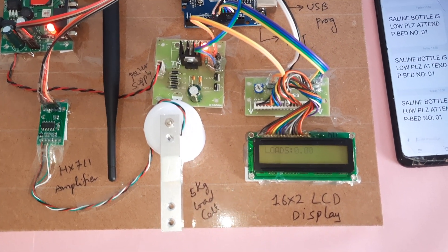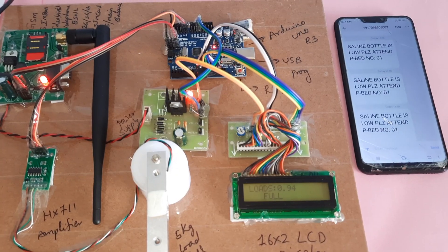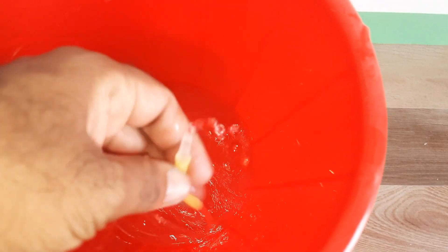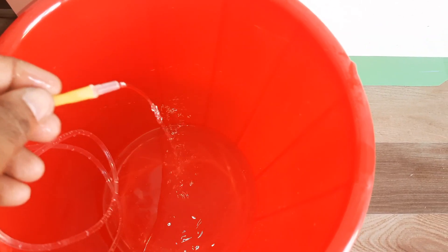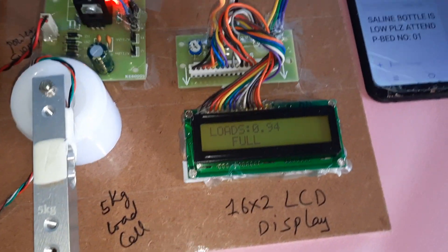Loads show 0.00 — here is the empty bottle. Now I am going to insert the water. I added the water — it is full.